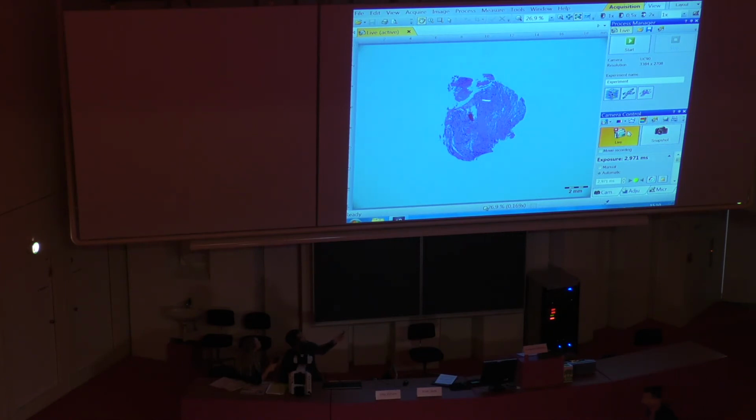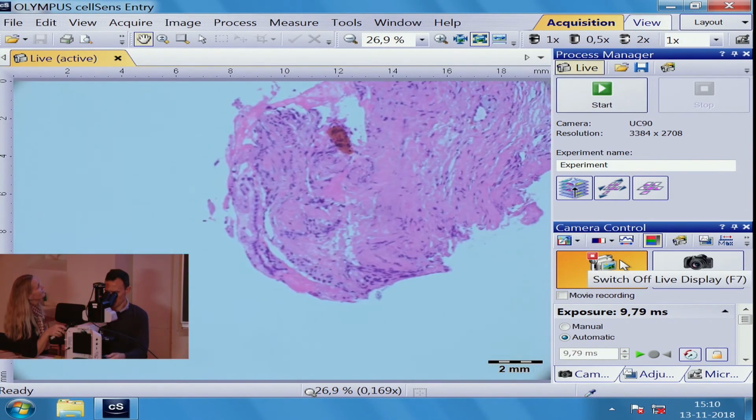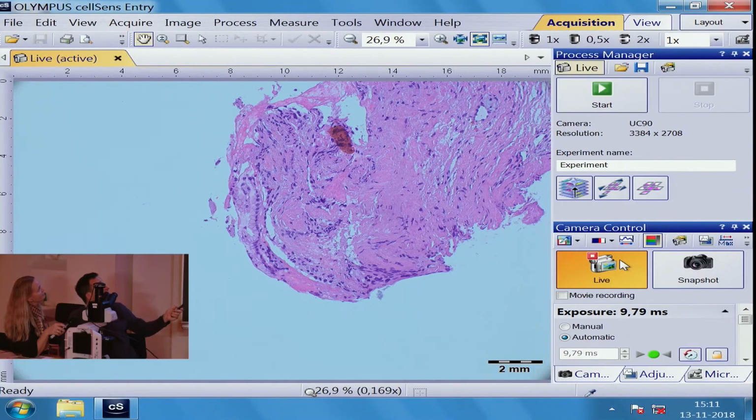but on part of the surface you can see a columnar epithelium, and the columnar epithelium is mucinous. I don't know if you can appreciate the mucinous cytoplasm of these columnar epithelial cells, but you should be able to see that the nuclei of these cells are quite bland, similar, and located basally in the cell.